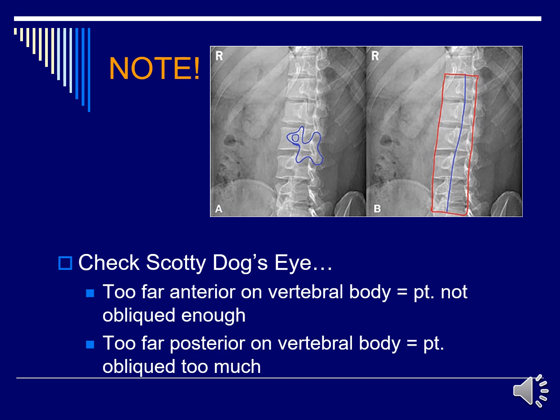If you're looking more for L4, L5, you only want a 30-degree rotation. But all of your clinical sites will do a 45-degree, and that should be your answer unless they are specifically giving you other indications to let you know that you're looking at other lumbar spine.